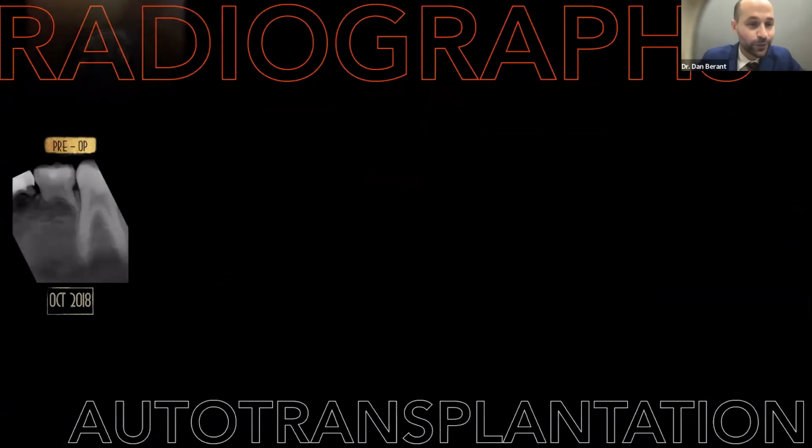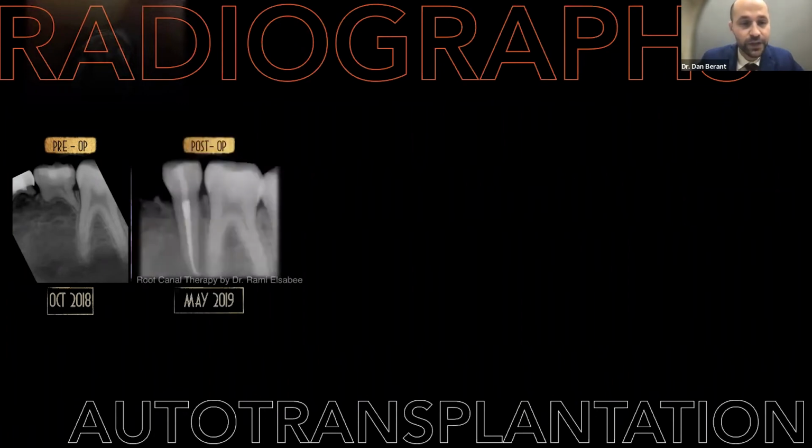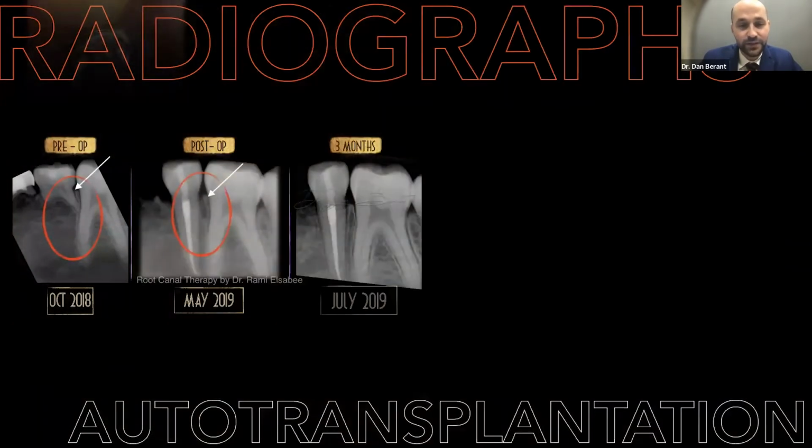Now, photos don't always tell the whole story. We're looking at the top of the iceberg. And so let's take a closer look at the x-rays during the course of her treatment. So here we see the immediate pre-op and immediate post-op x-ray. What I want to draw your attention to is this area here where the primary tooth had the distal root. At 3 months, we see the formation of what appears to be a lamina dura.